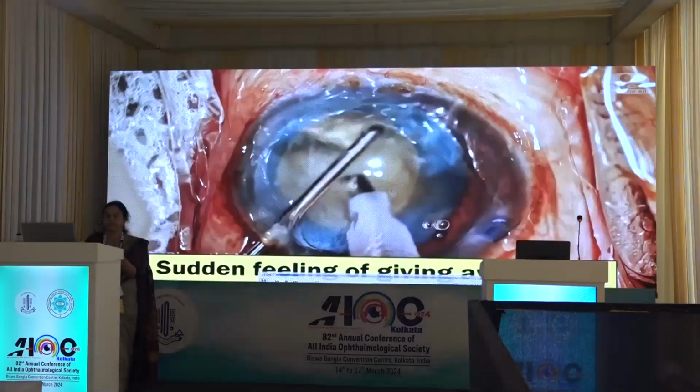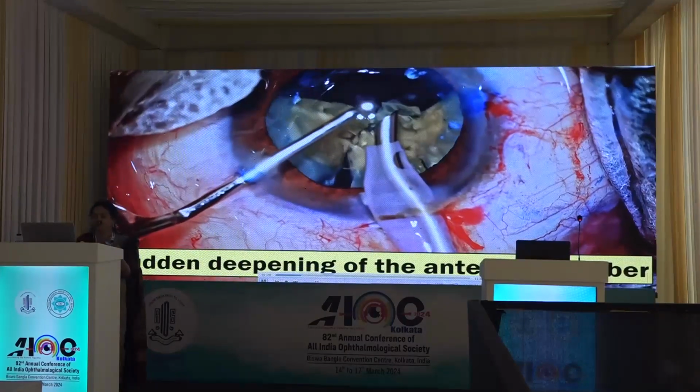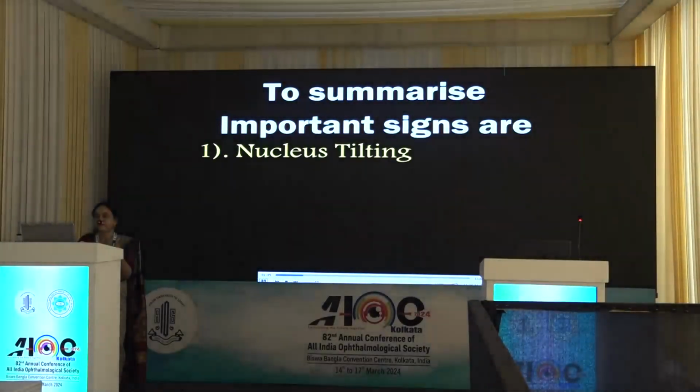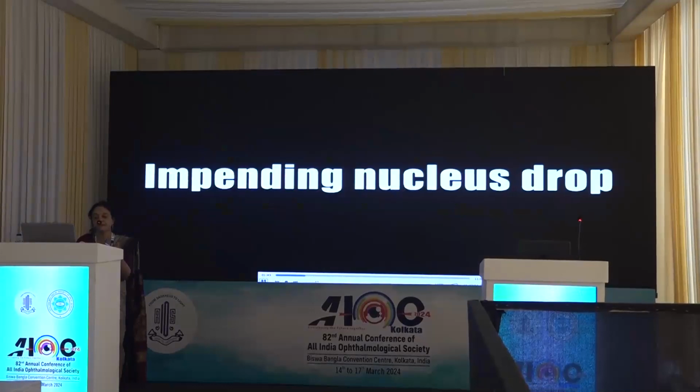Bright, unusual red reflex, a sudden feeling of giving away or pop, sudden deepening of the anterior chamber. To summarize, the important signs are nucleus tilting, poor followability, enhanced red glow, and sudden deepening of the anterior chamber.